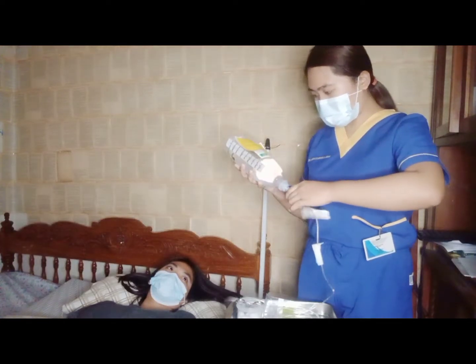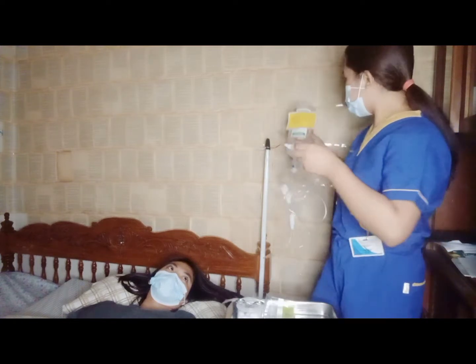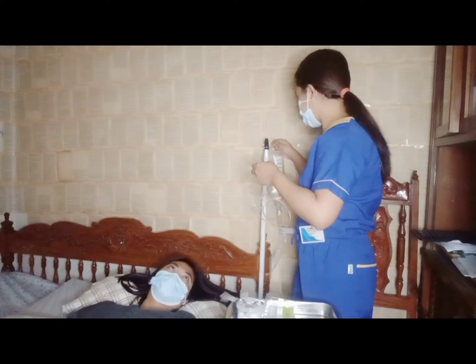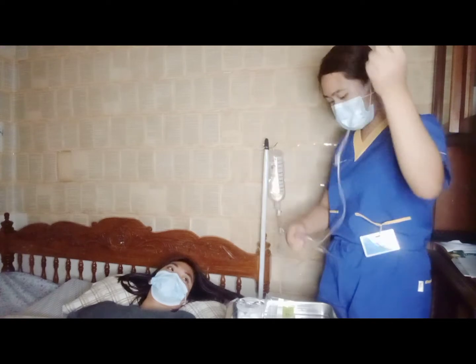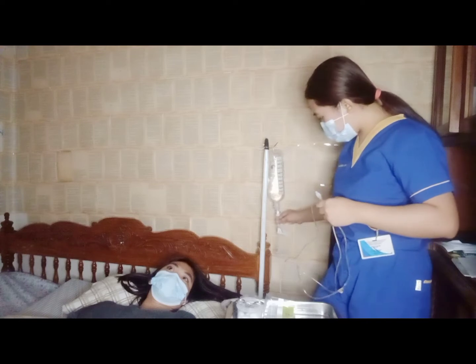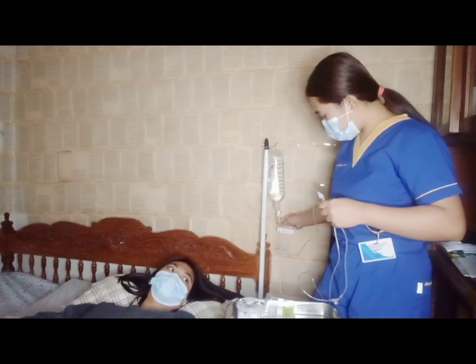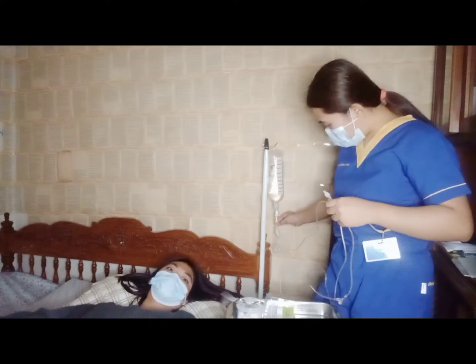Okay. So after inserting, we will hang the container. Then we will squeeze the drip chamber to allow the fluid to move inside the drip chamber. Fill it up to half of the drip chamber.